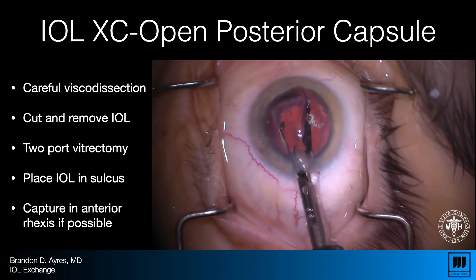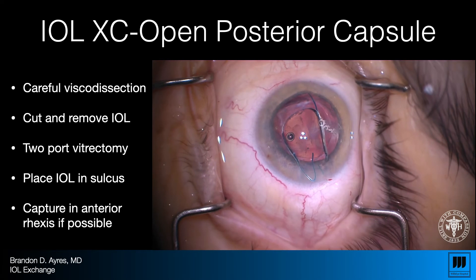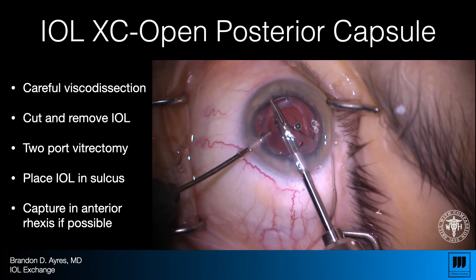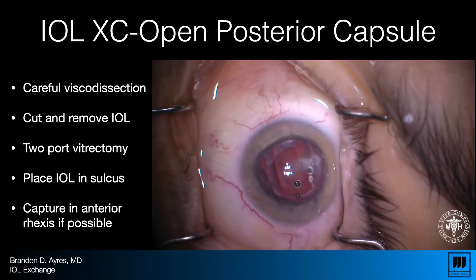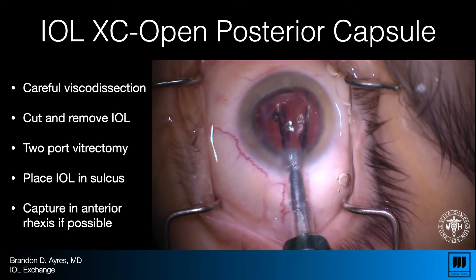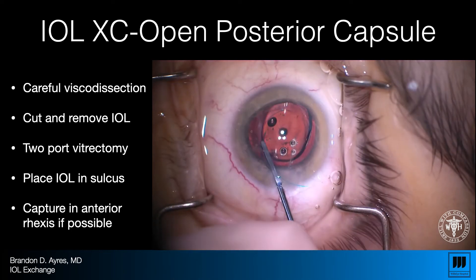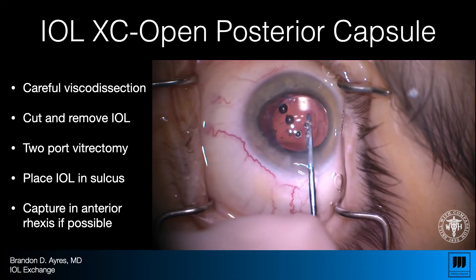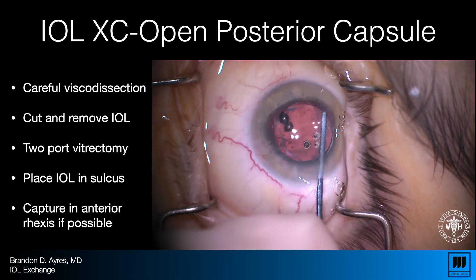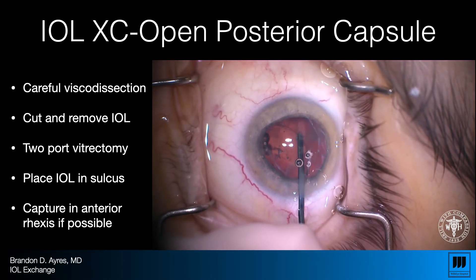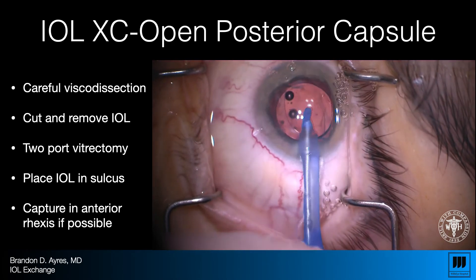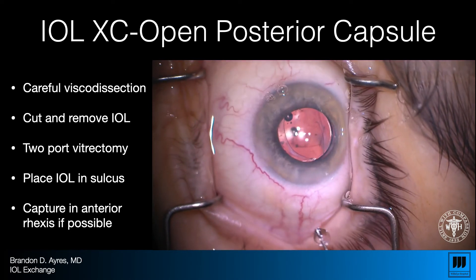My personal preference is optic capture. We're going to place the implant in the sulcus, hopefully without a bent haptic. I don't like to leave an implant passively fixated in the sulcus — I'll always try to either capture it in the anterior rhexis or suture it to the iris. I've seen too many sulcus lenses dislocate without some fixation technique. Pushing the implant through the anterior rhexis creates a football-shaped rhexis that locks the vitreous behind the IOL, with haptics sitting in the sulcus — a well-fixated and positioned sulcus IOL.